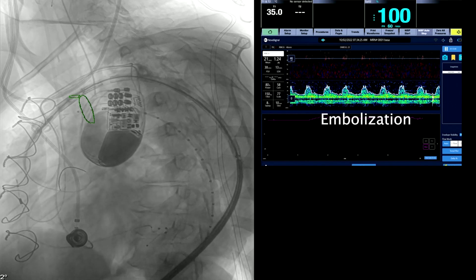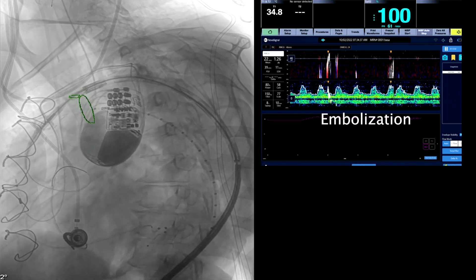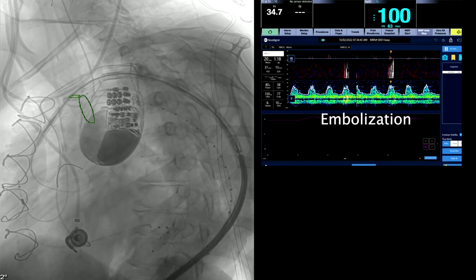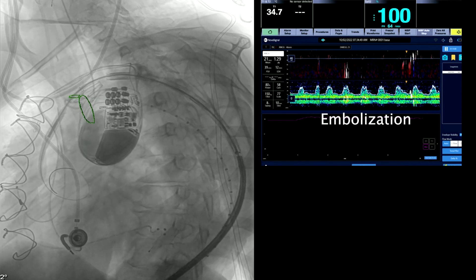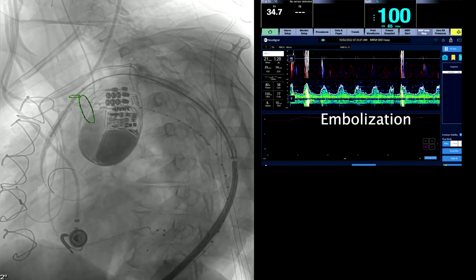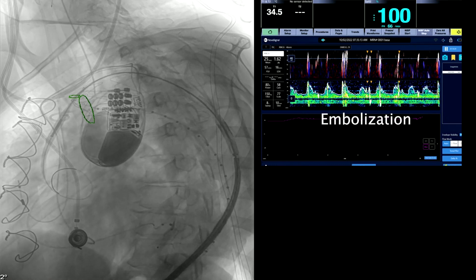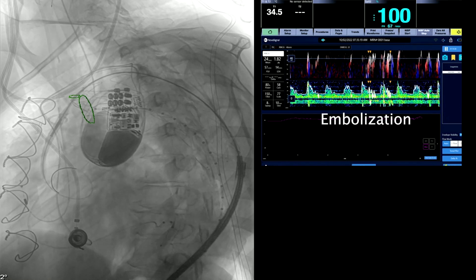Once we've got it in position, we're going to shoot an aortogram just to absolutely confirm. Obviously we want to be as far proximal as possible. We've already done that before we moved the fusion marks, and now we're actually starting to pin the device. You can see it's still tethered proximally, and now we're deploying the device.